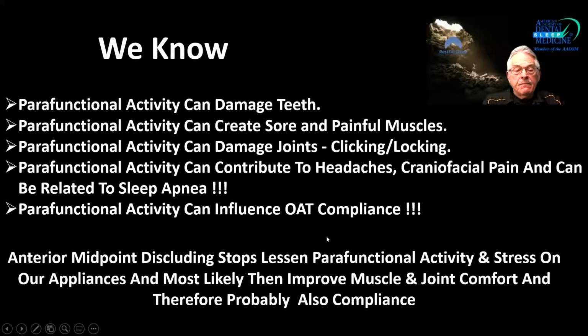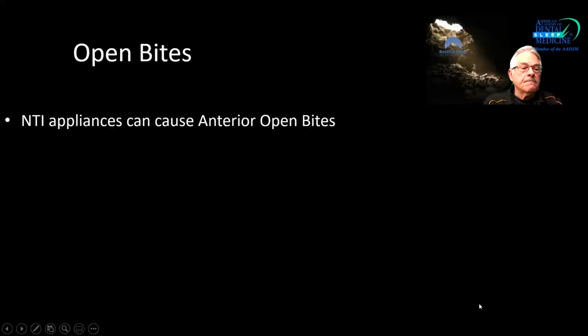Okay. Now I have nothing to base that on other than the years that I've been doing this. So there's literature out there that kind of supports this if you piece it together. But for me, coming from TMJ to sleep, obviously one of my biases is to put an anterior midpoint stop on my appliances. So we're going to address something a little bit different now, because there's some misinformation out there that NTI appliances can cause anterior open bites. Well, that's not misinformation, because it can, okay?